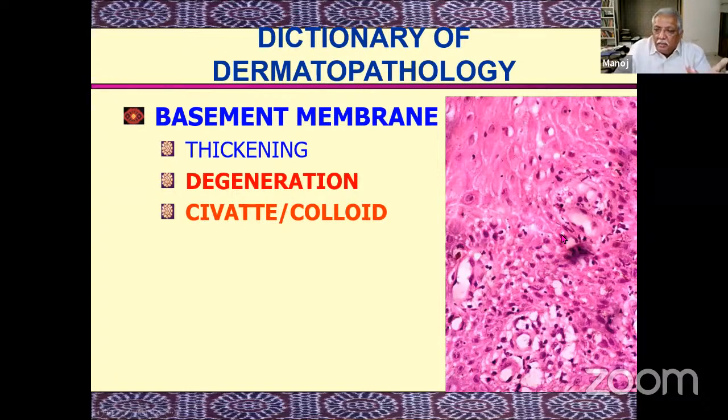You can hardly make out any membrane there, isn't it? Because of this dense, tremendous inflammation. And if you compare this with this structure, now this is not an inflammatory cell. This is not a lymphocyte. This is not any of the inflammatory cells. What is it? It has a pink cytoplasm similar to this, right?